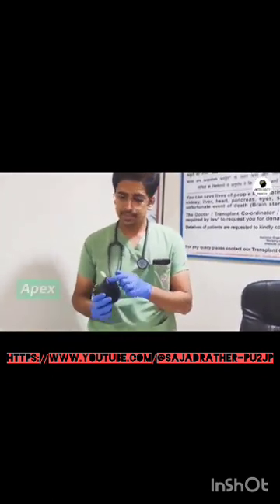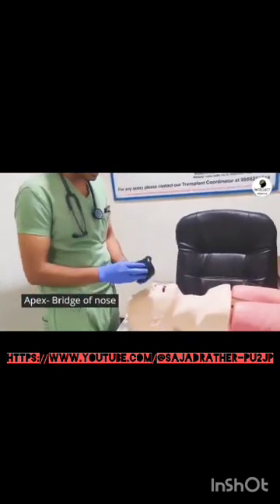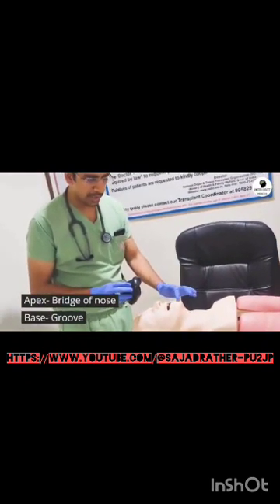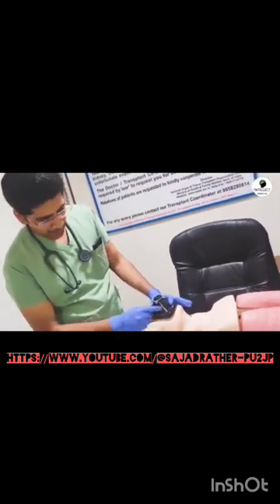Now how to check whether this is appropriate or not? This is the apex of a mask and this is the base. The apex should lie at the bridge of the nose, whereas the lower margin should go in the groove between the lower lip and the chin, like this. If you are not able to fit it, that means that size is inappropriate. You need to change. You need to have a larger or smaller size depending on the patient's face and anatomy.